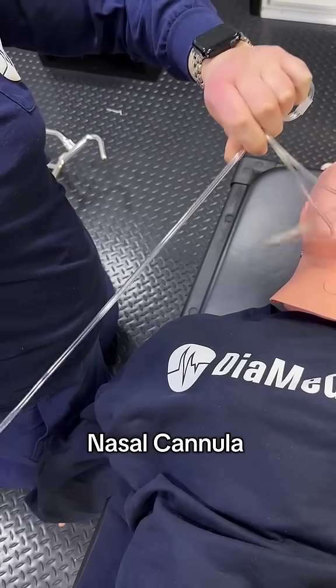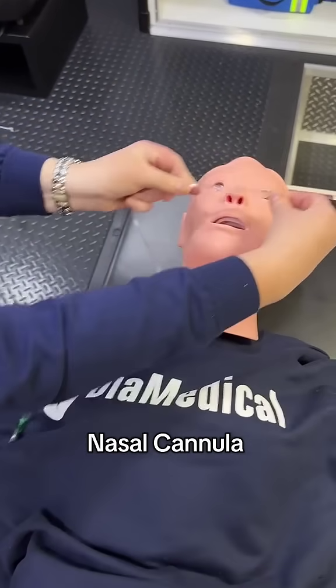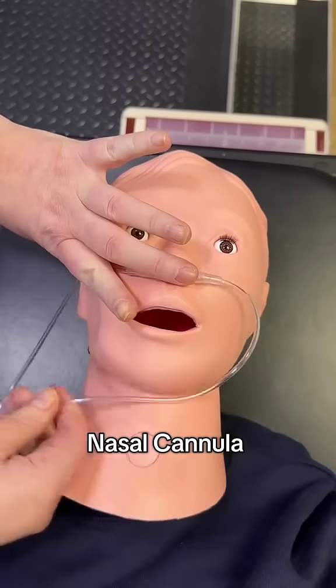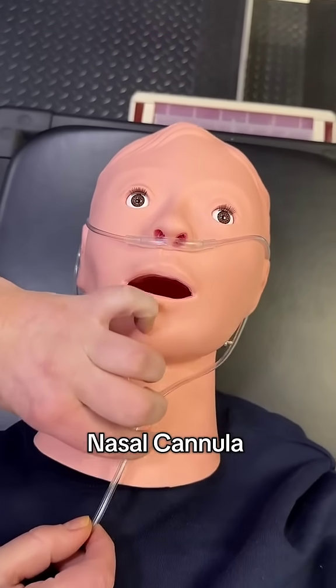Tip: stretch it out if it's very tightly coiled. You're going to place the prongs in the patient's nostrils first, then go ahead and put it over each ear. This is great for patients who need a little extra oxygen, but they can breathe on their own.